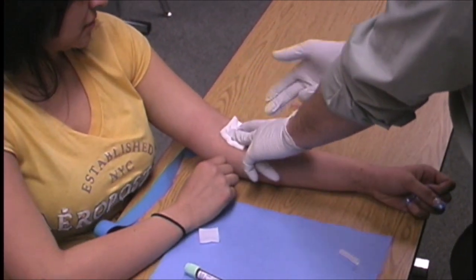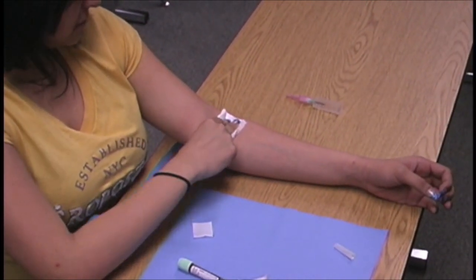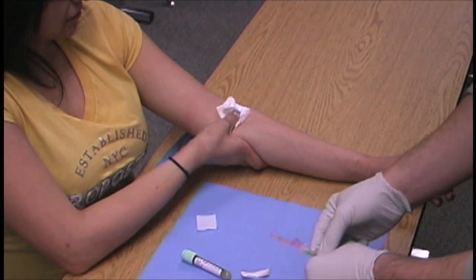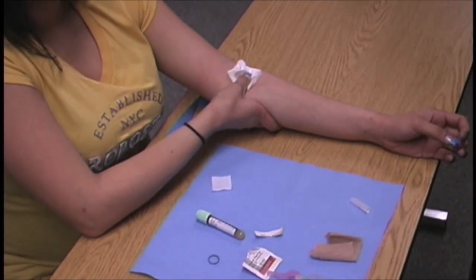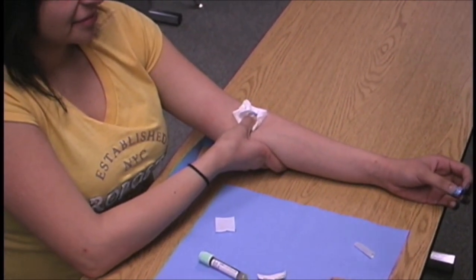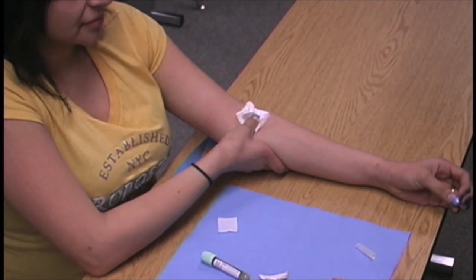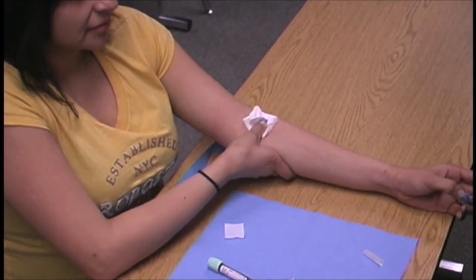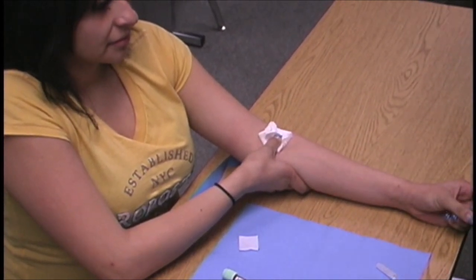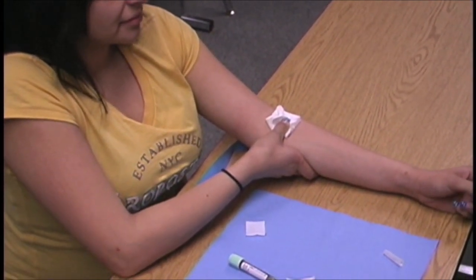He instructs Veronica to hold pressure for three to five minutes without bending her arm, applying pressure with her fingers or thumb. During this time, you want to talk to your patient to calm them — ask how they're doing, where they live. This takes their mind off the needle and off any fear from prior venipunctures. Keep talking to the patient throughout the entire draw.